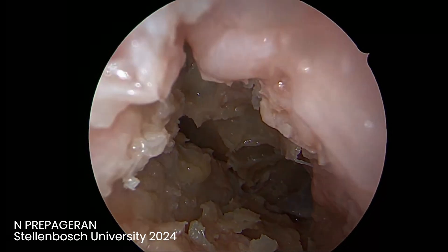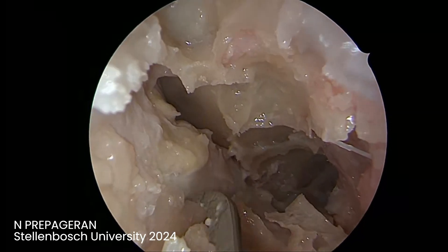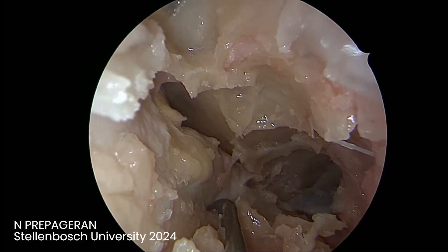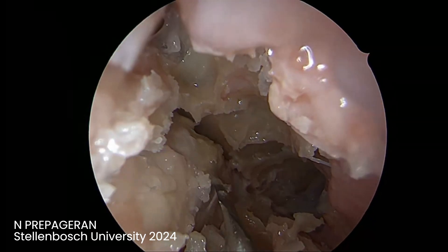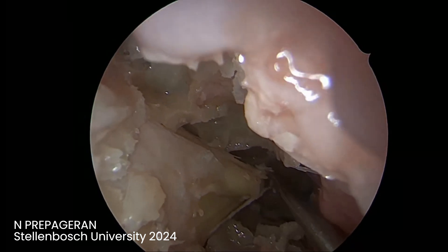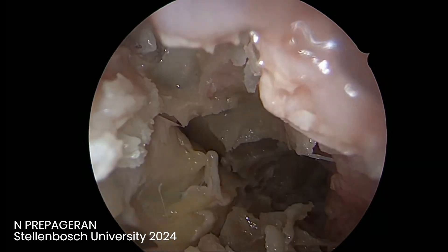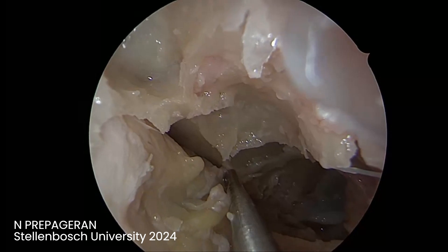I'm going to open up the periorbita. The classical teaching is to do three incisions, but being lazy as I am, I just remove the entire periorbita in one single swipe, then cut it all the way to the back. You remove the periorbita so that the entire orbit decompresses.